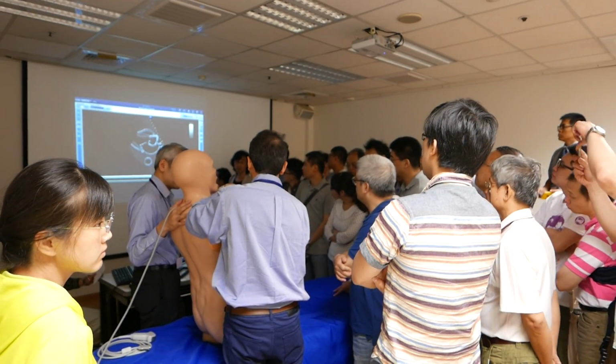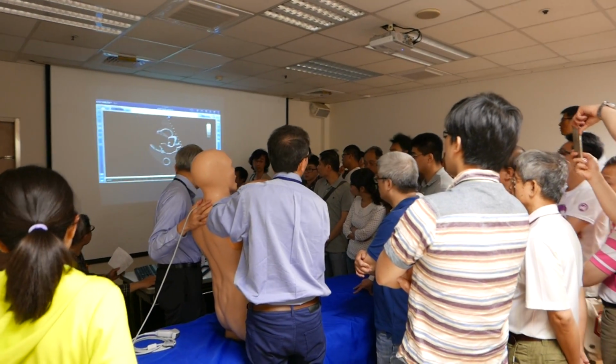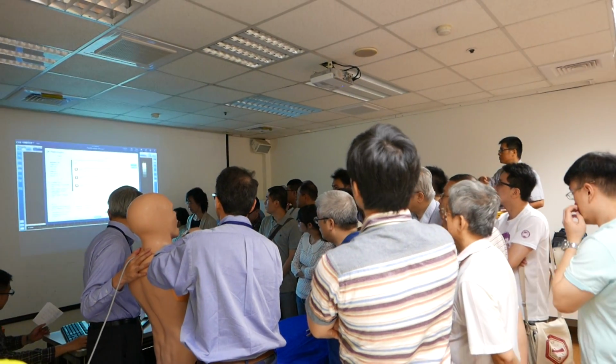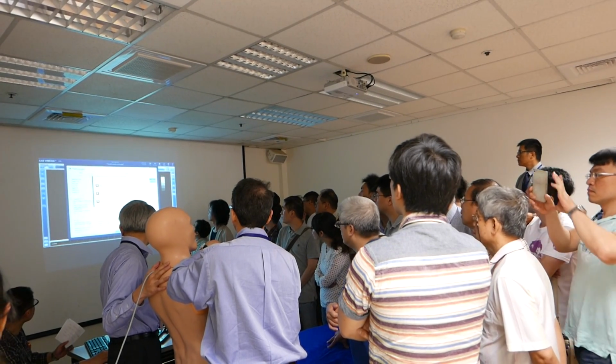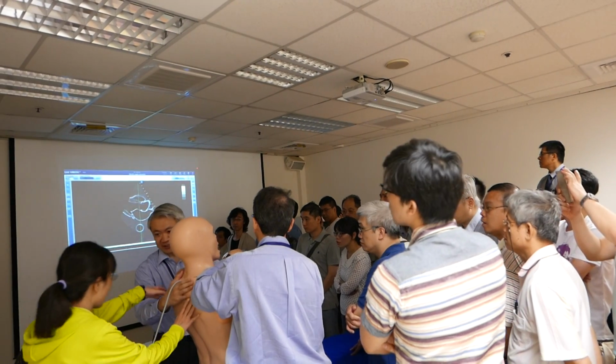Now, is it possible to activate the M mode here? I don't know. M mode. M mode from... M mode, just to show where we are.